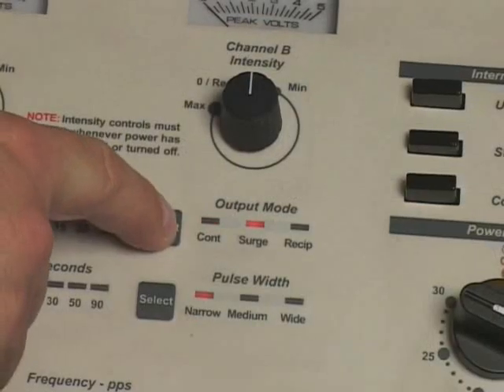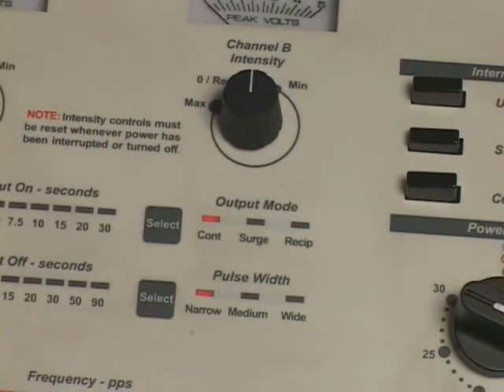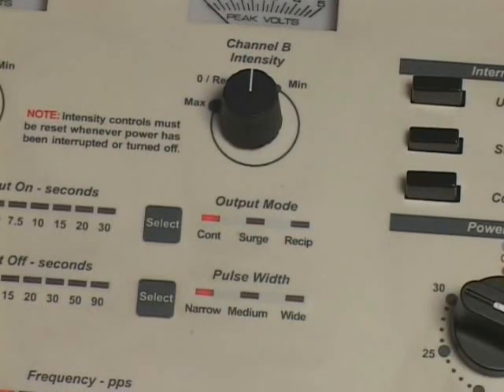Press and release the output mode control until the continuous output mode is selected. The output mode indicator light array will indicate the output mode selected. The output mode selection can be changed at any time during treatment. Always set the channel A and channel B intensity levels while in the continuous output mode.